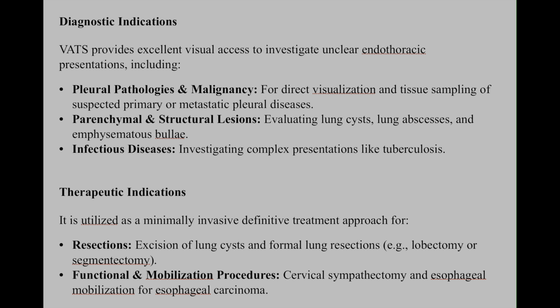Therapeutic indications. It is utilized as a minimally invasive definitive treatment approach for resections, excision of lung cysts, and formal lung resections, for example lobectomy and segmentectomy. Functional and mobilization procedures: cervical sympathectomy and esophageal mobilization for esophageal carcinoma are done.